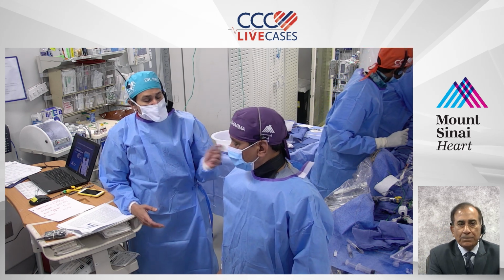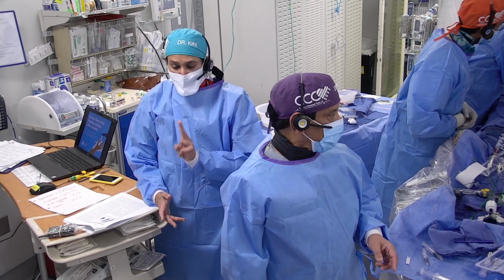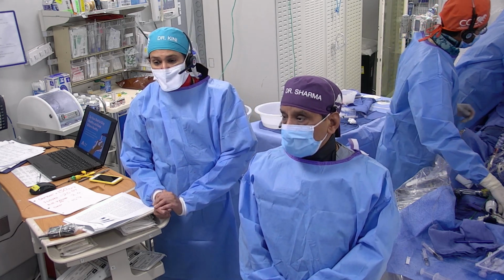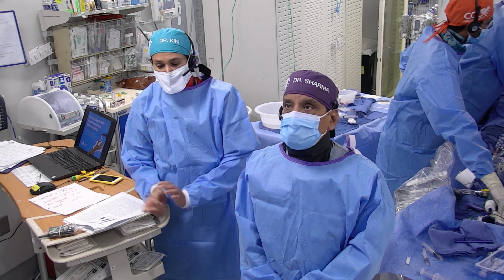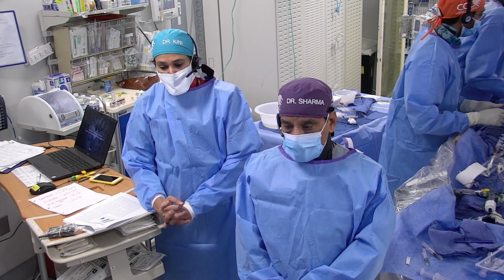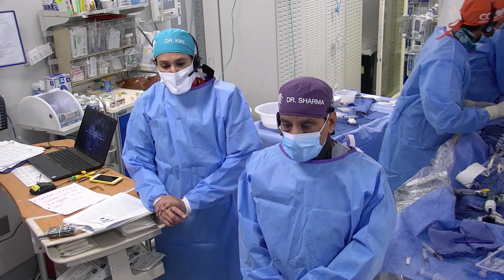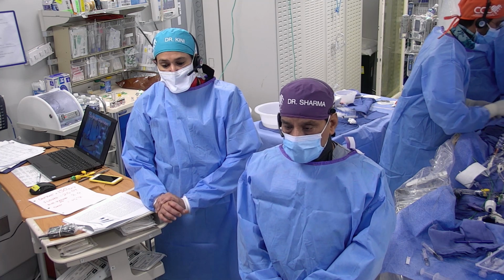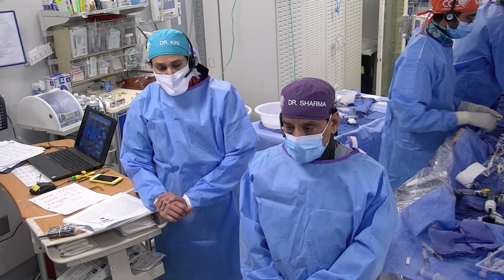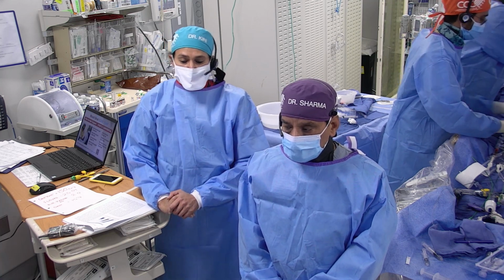Yeah, we already had the laser here. If the microcatheter did not cross, there are two things you can do. One, you take out the microcatheter. To remove it, you have to do wire trapping. You put a 2.5 balloon side by side, get your microcatheter to the arch area, wire trap with the 2.5 balloon, remove the microcatheter, and then go ahead with a guide extension, whether it is Godzilla or anything else, and then with a 1.0 or 1.5 balloon, any of these you can try.